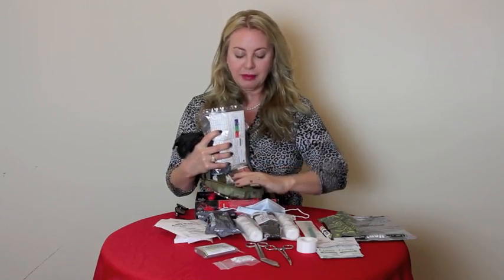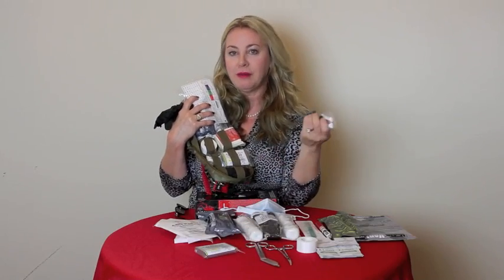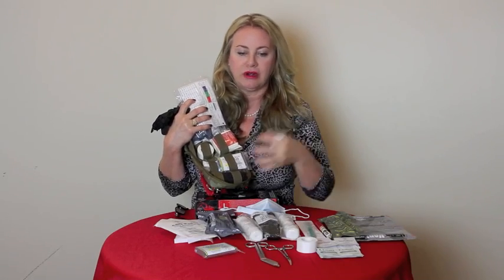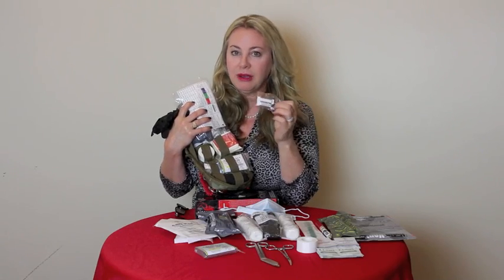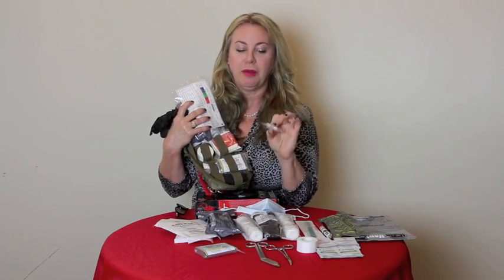Now next to the Mylar blanket are two ammonia inhalants. Again, why ammonia inhalants? If you come upon somebody who is passed out on the ground or just on a trail and there's no obvious injury, you might want to try to wake them up with these ammonia inhalants. Very simple. You pop them.